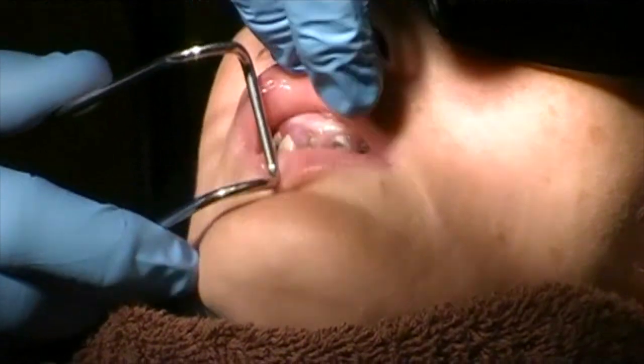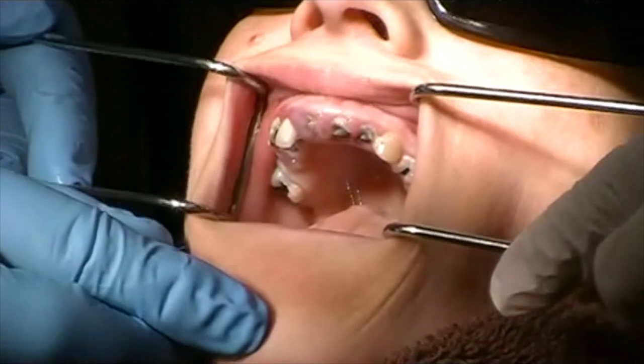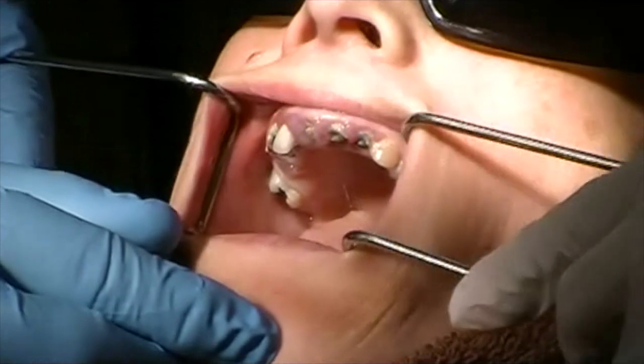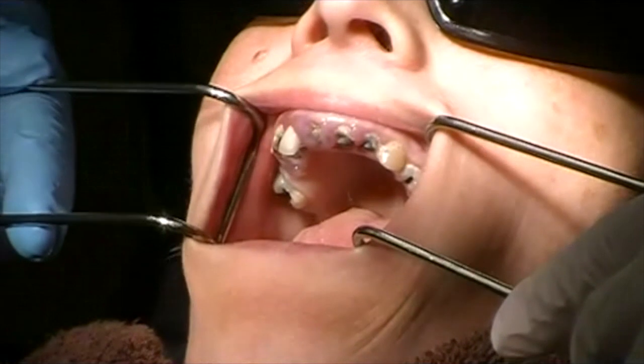You can see we have a lot of broken down teeth. We do have some fully erupted mandibular teeth that we will also extract.